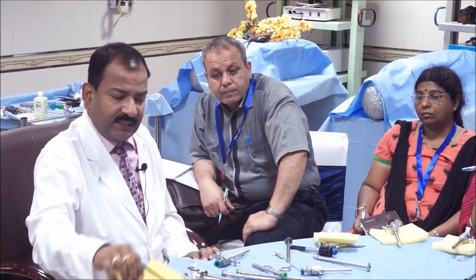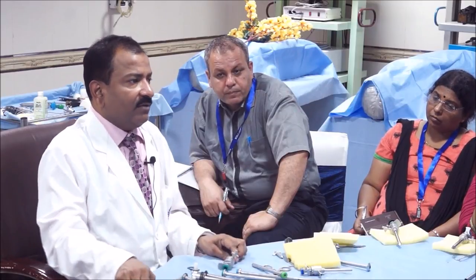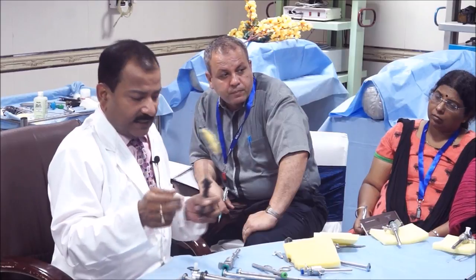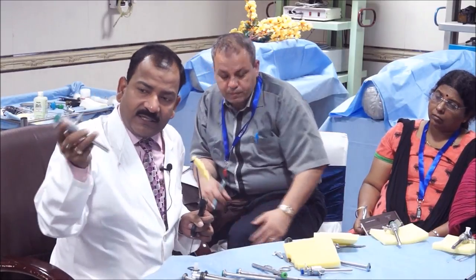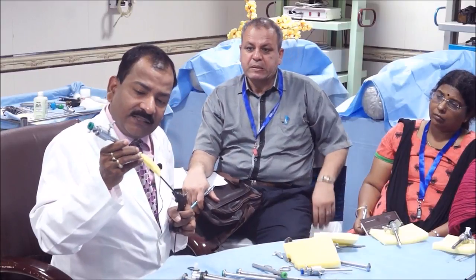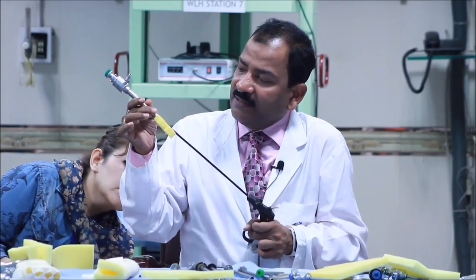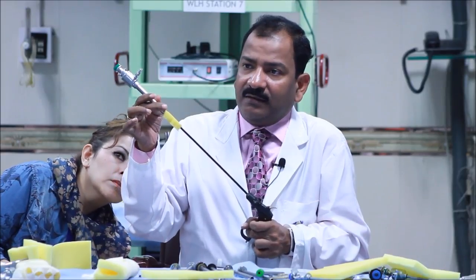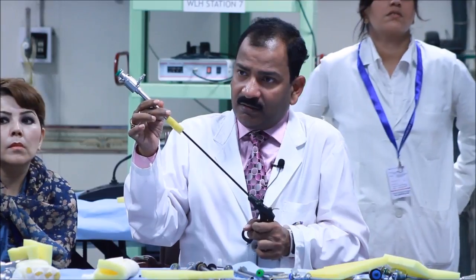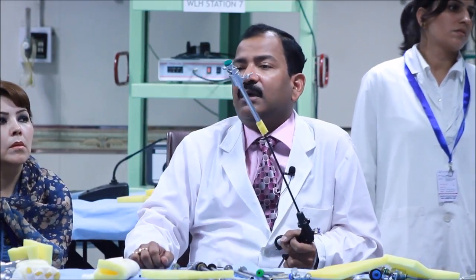What is reverse feeding? Suppose this is the appendix and they have only one cannula. Then what they do? They catch the appendix this way, and suppose this is the telescope, they tell the assistant, okay, pull the telescope back, and the assistant is pulling the telescope back and they are pushing the appendix in like that. You are doing this in the gallbladder? In the gallbladder, how can? No, no, umbilical port, umbilical port.